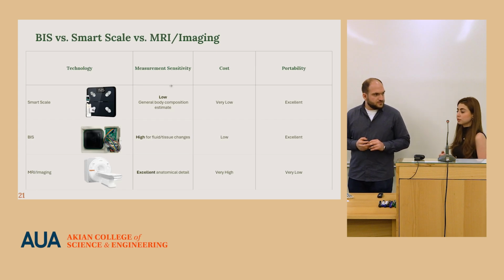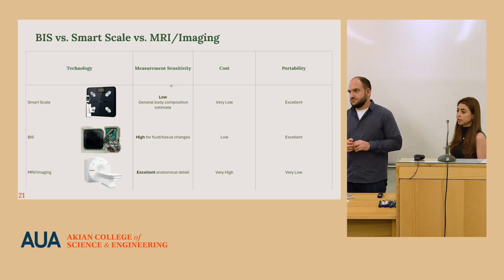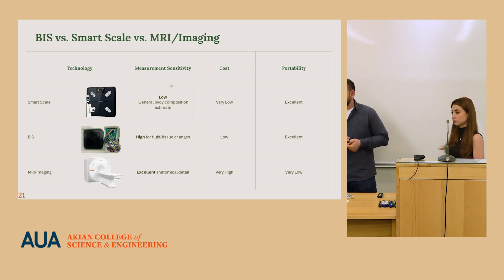For this device, there is no need for the statistics to be implemented because it has the ability to measure the intracellular parts, which is the most important one. The single frequency ones do not have that ability. That is why they are using the statistics. So it doesn't make any sense to add statistics on top of what you have.